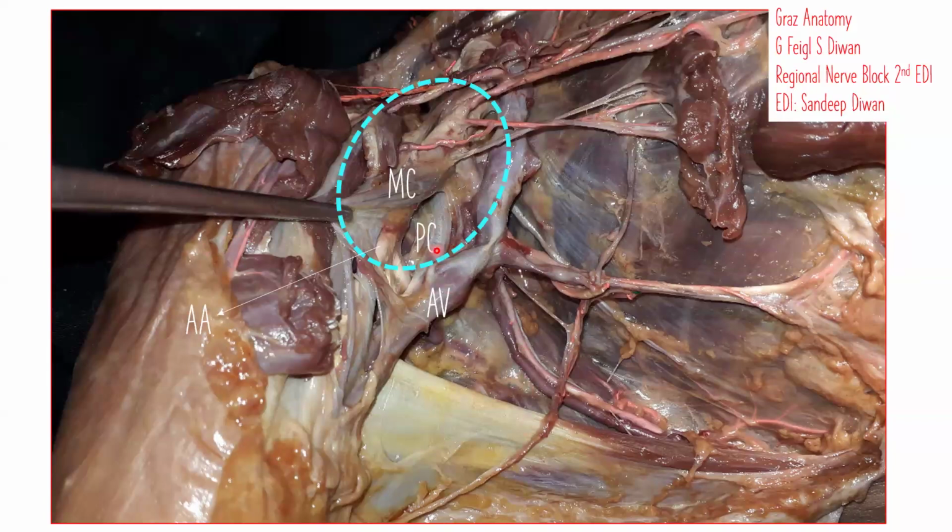So here, what we see is the axillary vein. This is the entire axillary vein. What you can see here is the artery, the axillary artery, and you can see the posterior cord, which lies exactly below, posterior to the axillary artery.